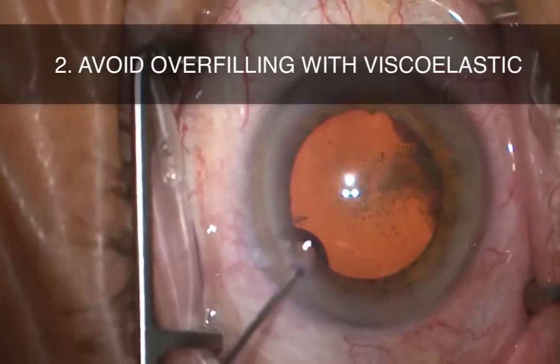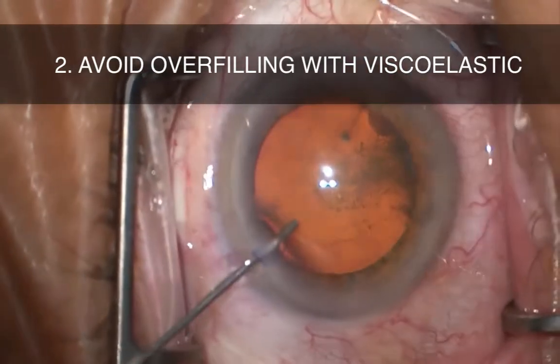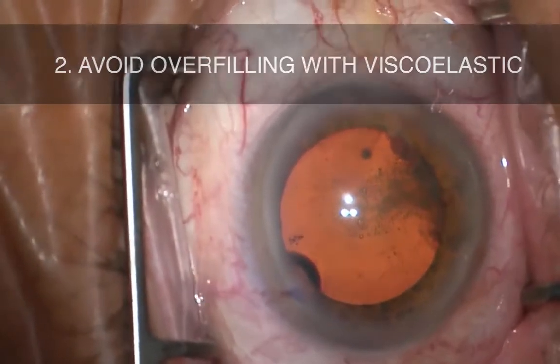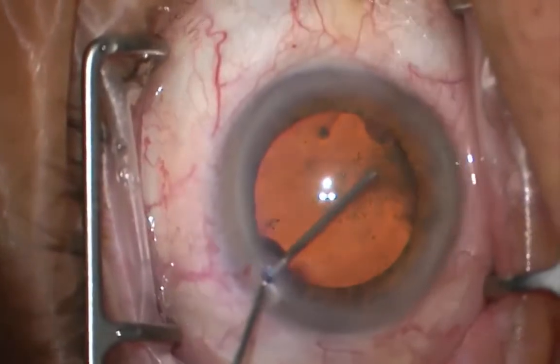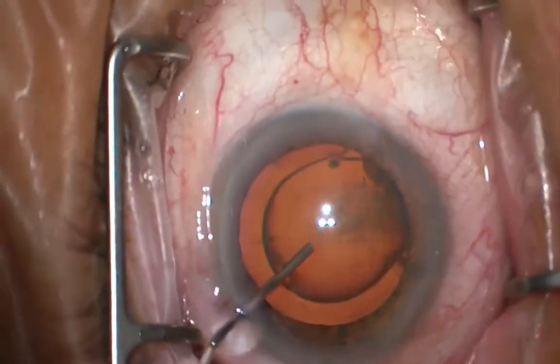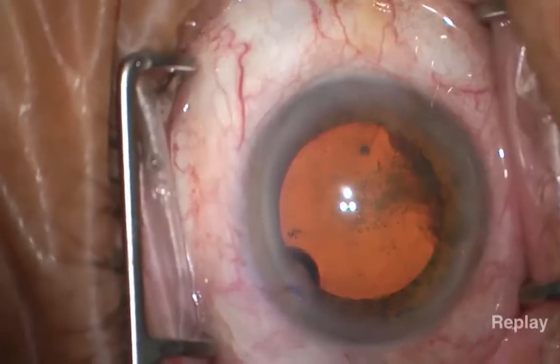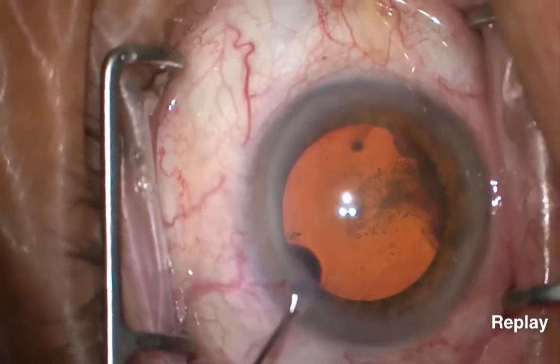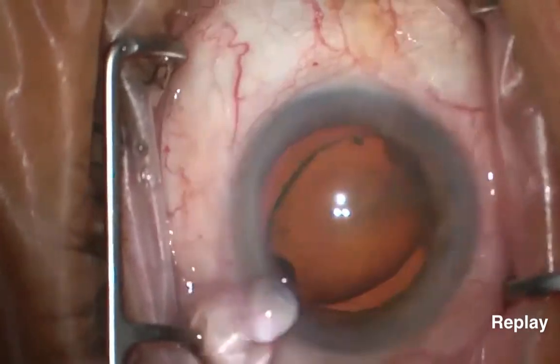Tip number two is to avoid overfilling the anterior chamber with viscoelastic. Beginning cataract surgeons, myself included, often overfill with viscoelastic as it is easier to make the main wound in a firm eye. However, this creates a larger pressure differential between the anterior and posterior chambers and increases the risk of iris prolapse, particularly during hydrodissection. A rule of thumb I try to follow is that if I am getting a lot of viscoelastic spilling out of the paracentesis, I have probably overfilled the AC and should be wary of possible prolapse.